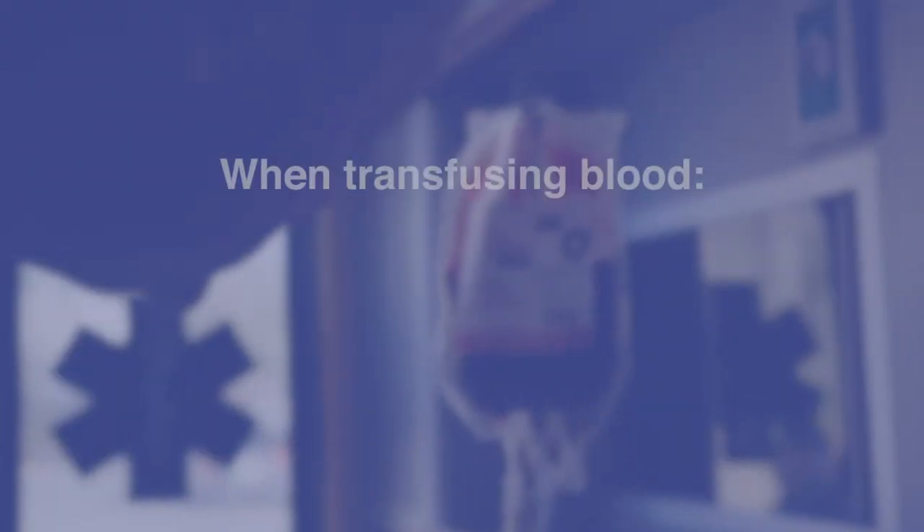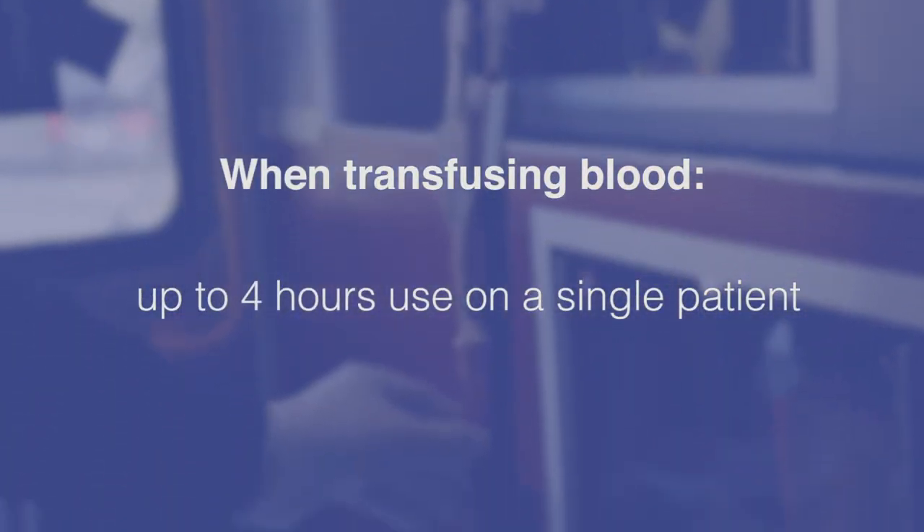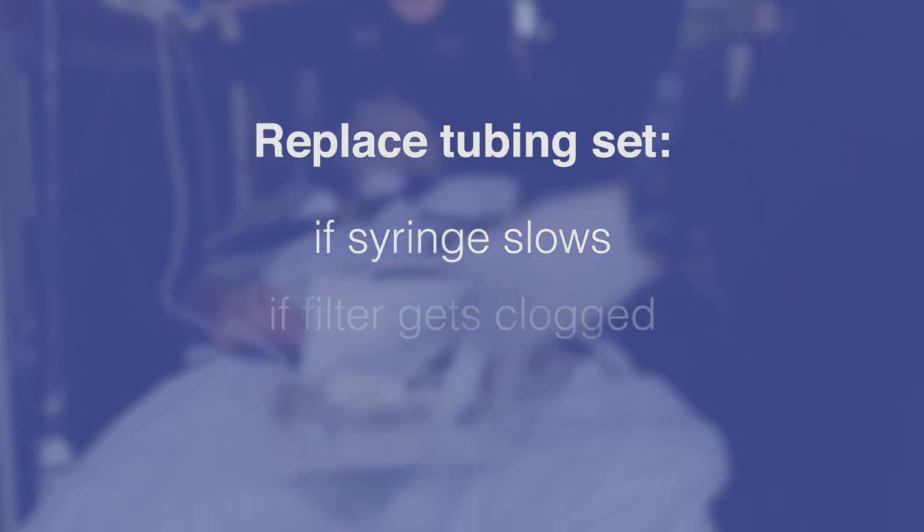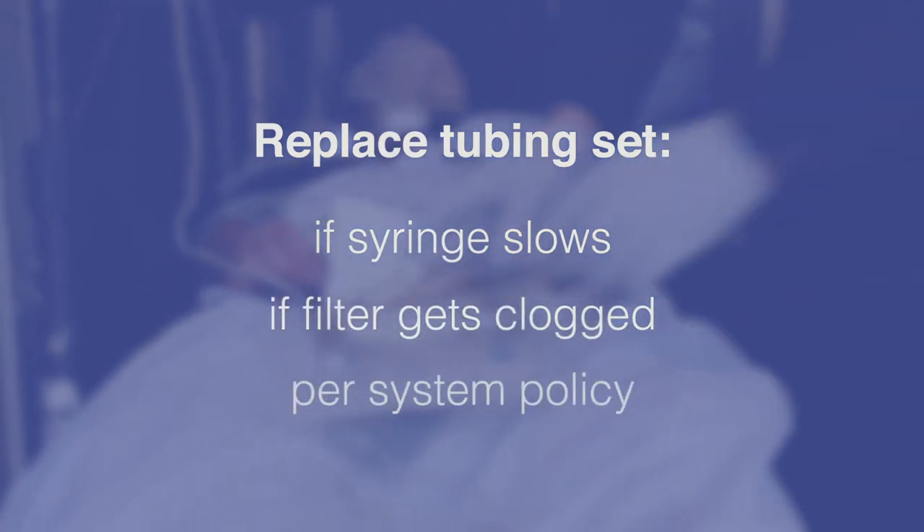When using LifeFlow Plus for blood products, this device can be used on a single patient for up to 4 hours. Consider replacing the tubing set if the syringe slows or the filter gets clogged, or per system policy.